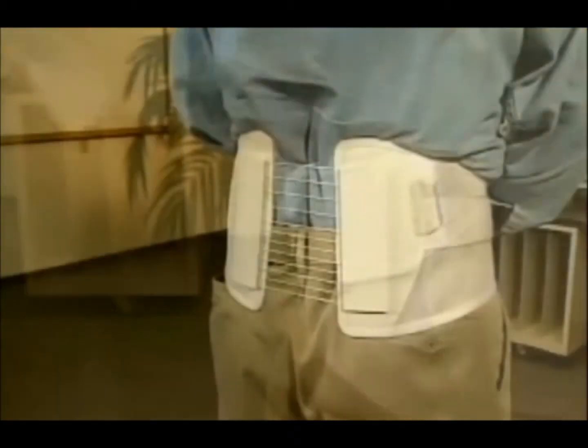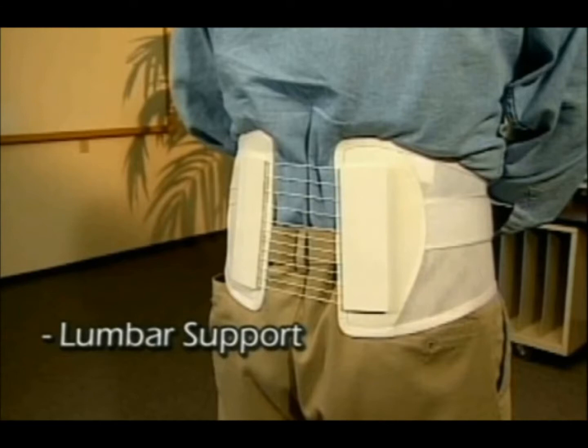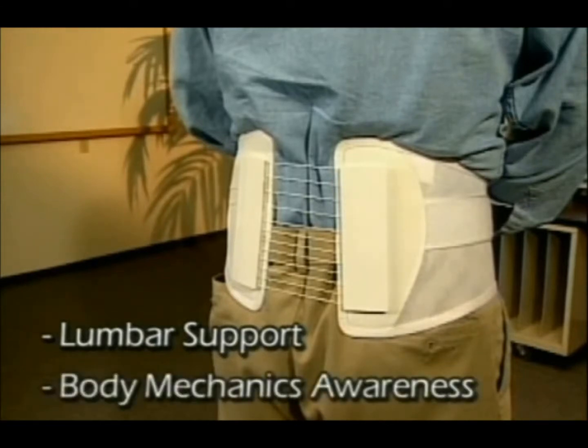You loosen the brace by reversing the procedure. There are two distinct benefits to this brace. First, it will give your lumbar spine additional support, and it will also act as a terrific reminder to use good body mechanics while going about your daily tasks.